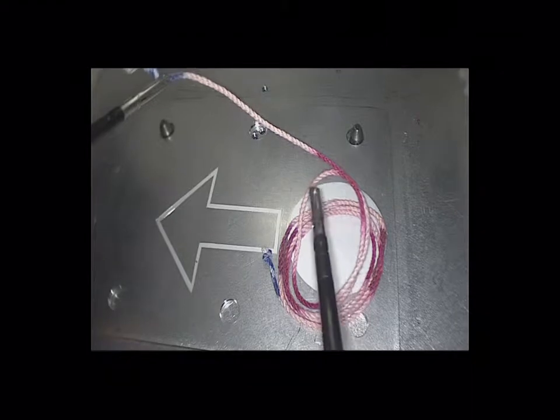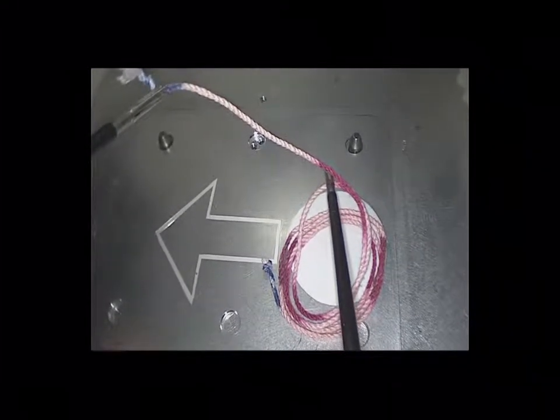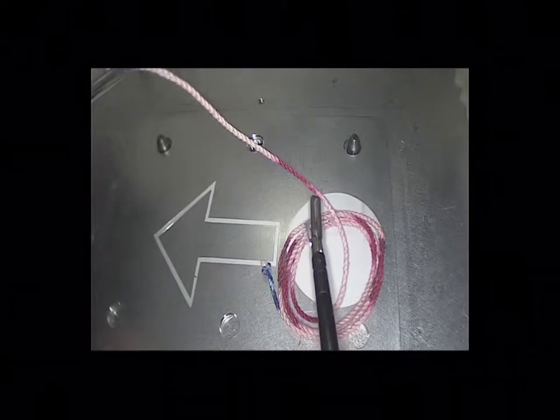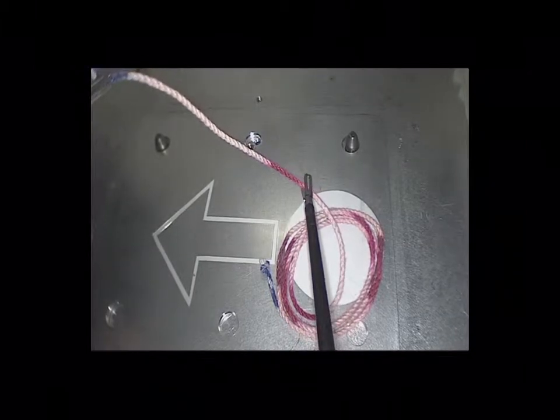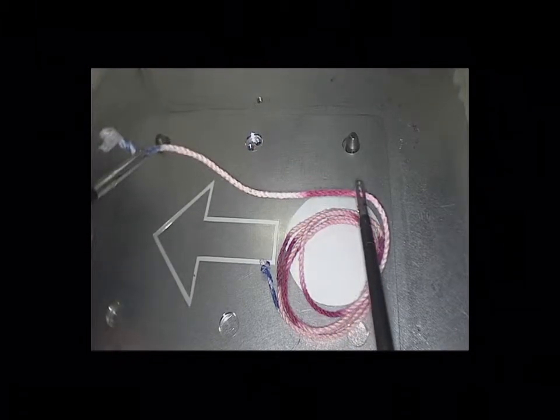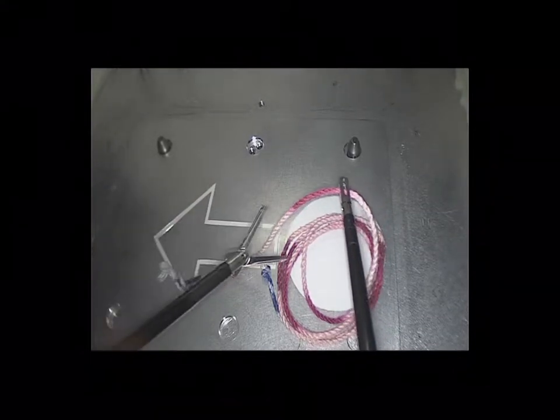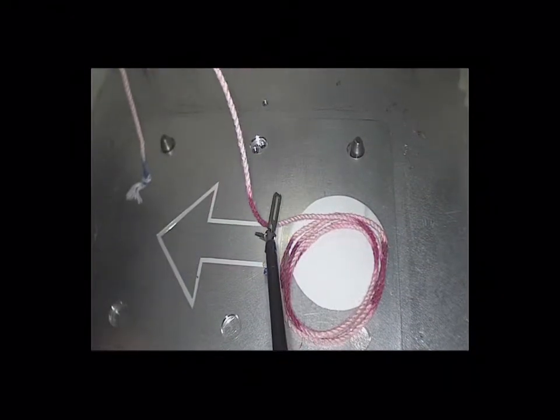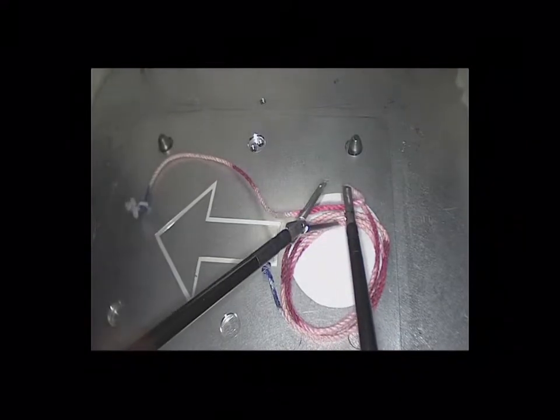Go to the 11 o'clock position in the corner. As you can see, this is sticking, so just hold it firm to be able to visualize your targeted area. Grab here, keep it over this area, and straighten out the rope so you can come in and, without pushing the rope down to the floor, conduct the procedure like so.